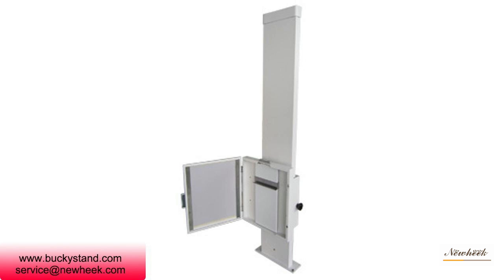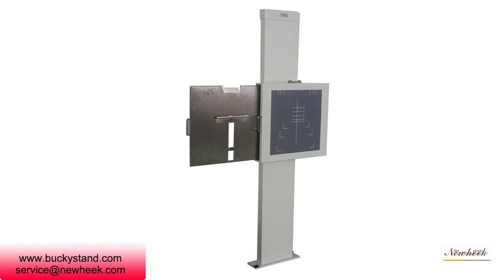In addition, our bucky stand can receive 3 static imaging methods: film, IP plate and flat panel detector. Newheek bucky stand can meet your different purchasing needs.